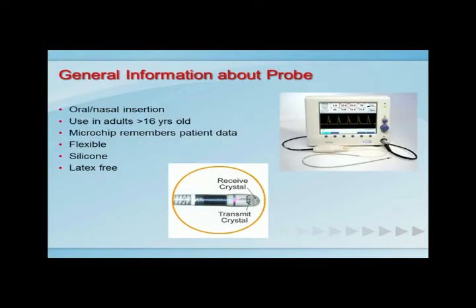General information about the probe. The probe can be inserted either by oral or nasal insertion. In adults greater than 16 years old, the microchip remembers patient data initially entered on the patient data screen. It's flexible, it's silicone, and it's latex-free.